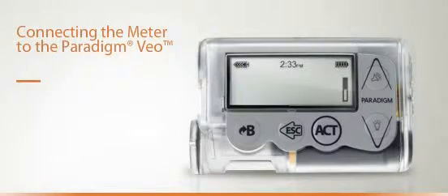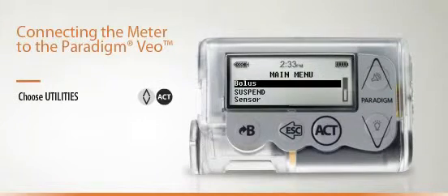If you use your Paradigm Veo in conjunction with a Bayer contour link meter, blood glucose readings will be sent automatically from your meter to your Paradigm Veo. To add a Bayer contour link meter, scroll to the Utilities menu, then press Act.